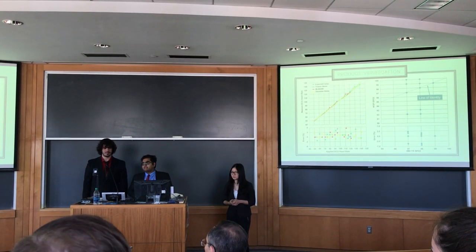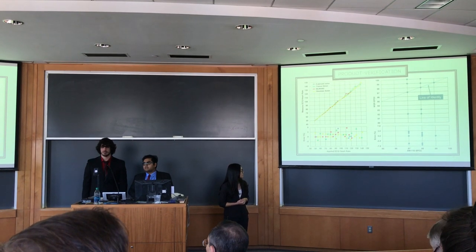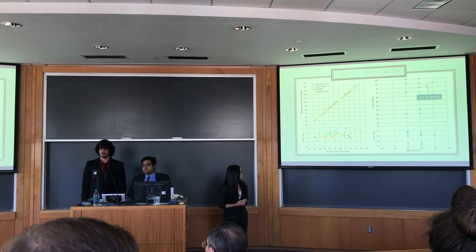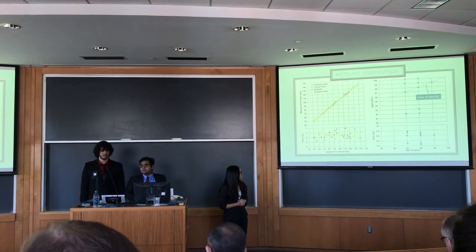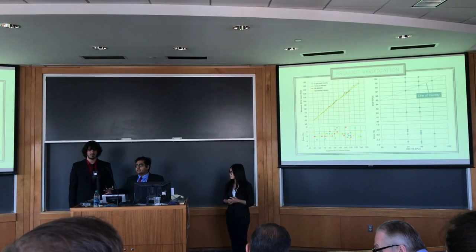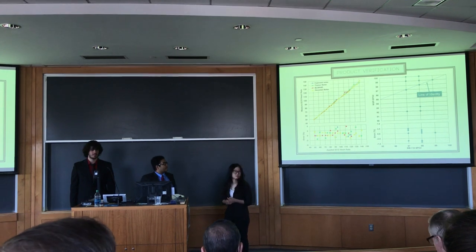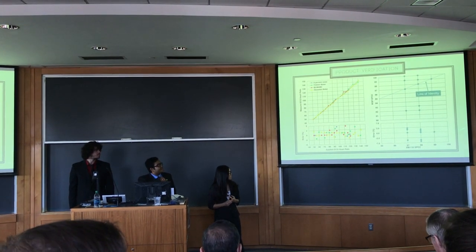So actually, while you have this slide up, another question. The pulse oxygen saturation looks great. You were within 3%, but isn't it the kind of thing where if it drops to like 95, you've got a real problem? Right, so the range is about 96 to 99. Over 99 is inaccurate because you cannot have 100% hemoglobin in your blood. Below 95, it's inaccurate. You can see all the set of data are within 97 to 99 in that range.